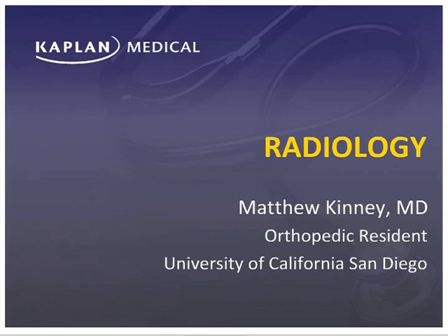For those of you who have not had a chance to review the surgery section yet, my name is Matt Kinney, and I completed medical school at the University of Virginia and am now an orthopedic surgery resident at UC San Diego. Over the next 3 lectures, we will discuss the high-yield radiographic subjects you will see on your exam, including the indications for each radiologic test, the normal appearance of anatomic structures, and some of the pathologic findings that you may expect to see on your exam.